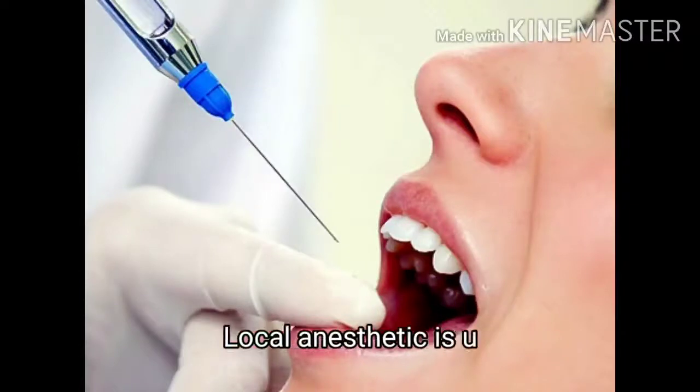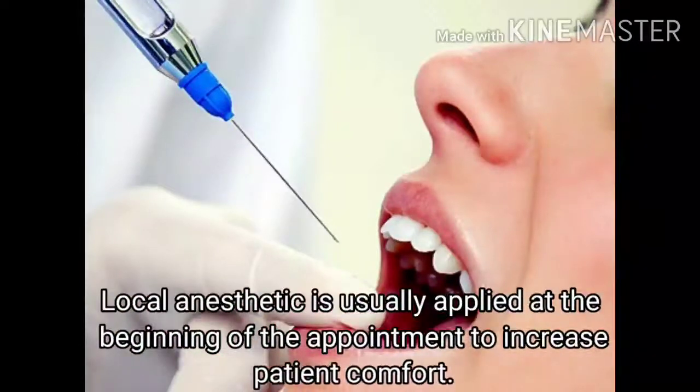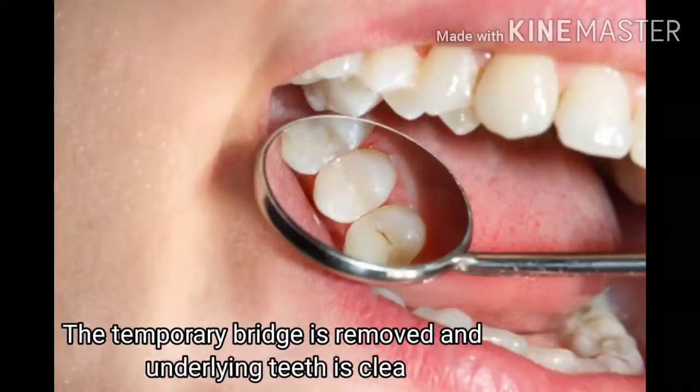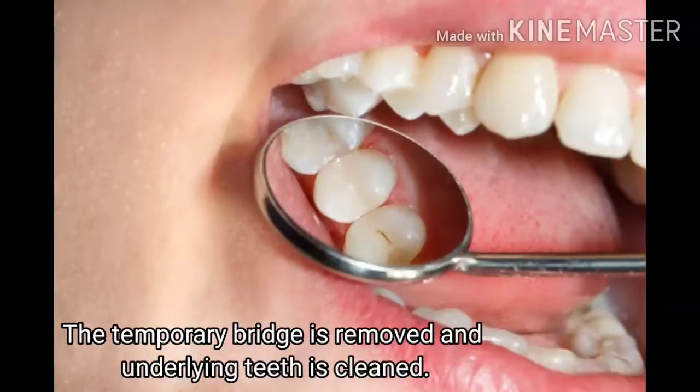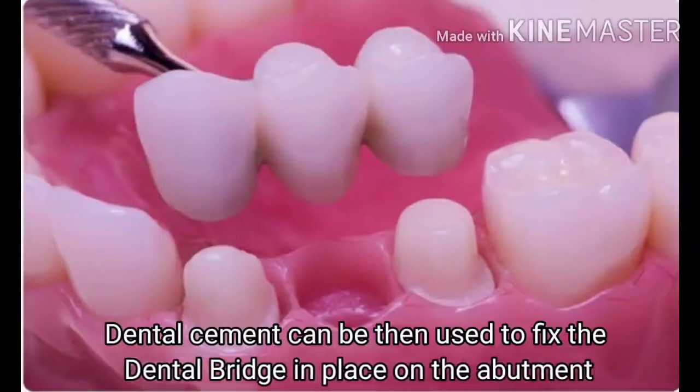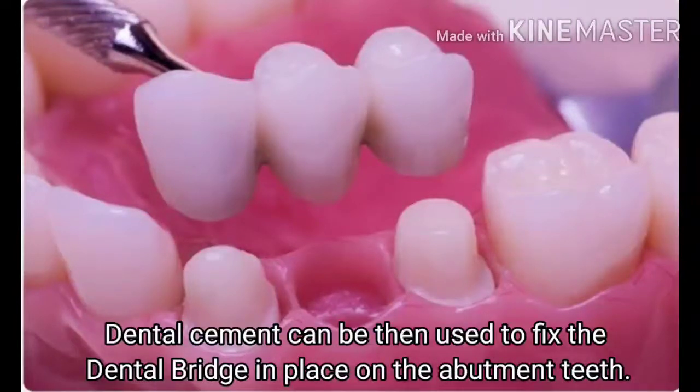The second appointment includes permanent bridge placement. Local anesthetic is usually applied at the beginning of the appointment to increase patient comfort. The temporary bridge is removed and the underlying teeth are cleaned. Dental cement is then used to fix the dental bridge in place on the abutment teeth.